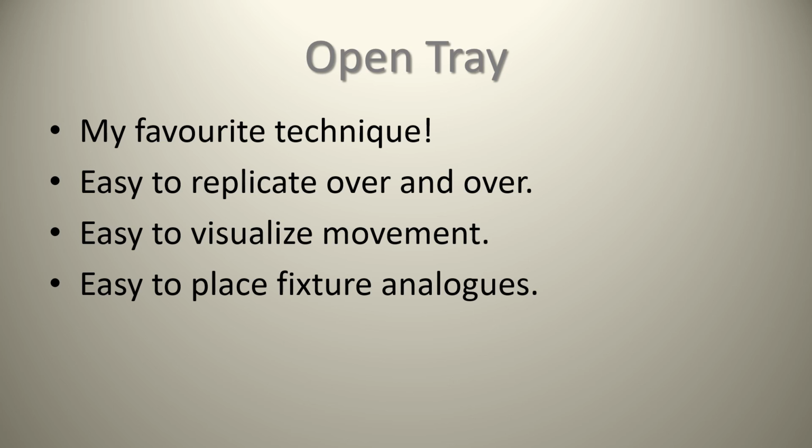So it's important to ensure that whatever information is being sent to the lab is as accurate as possible from our perspective, especially if you have a less than forgiving lab who basically makes you responsible for the financial costs that are associated with errors.